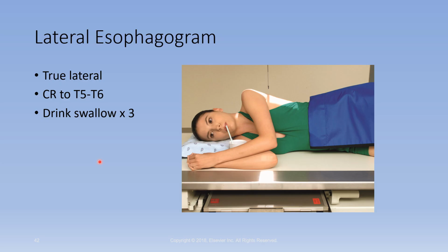I realize I did not give you technique on this. The technique on the RAO would be 110 kVp at 2 mAs.